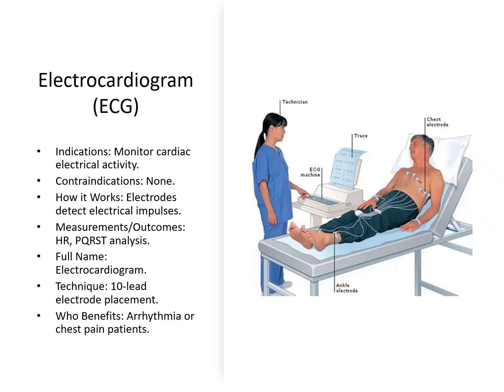The full name is electrocardiogram. Techniques include placing 10 electrodes in their proper positions. It benefits patients with arrhythmias or chest pain.